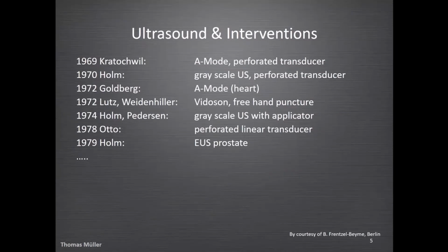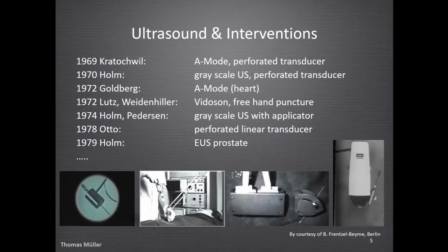We need good guidance. Ultrasound seemed to be a good idea as a guidance tool since the 1960s. In Austria, Kratochwil and others started to use ultrasound as a guidance tool. As you can see, there were many pioneers and publications in the 1970s who tried to use ultrasound as a guidance tool. Here you see some images of ancient ultrasound transducers used as guidance tools, and they look a little bit like, well, 20th century, and in fact they are. Since then, the development has been rapid, and I will show you some of the most modern tools we have today.